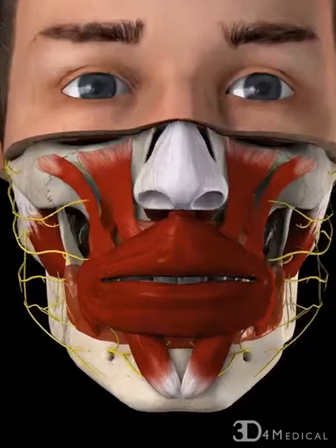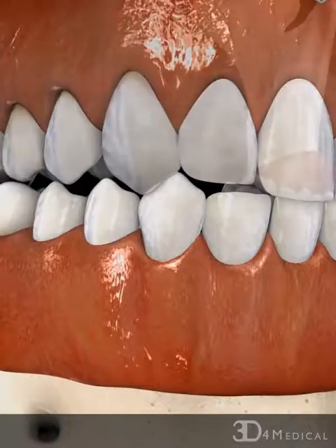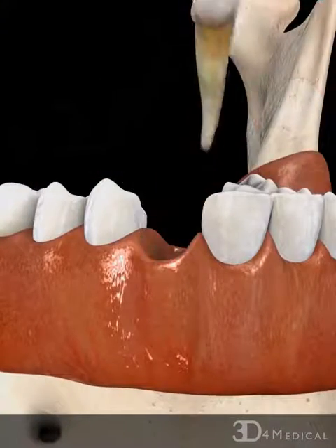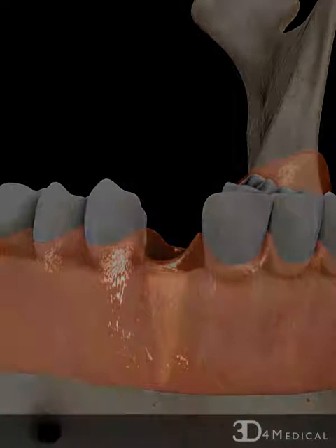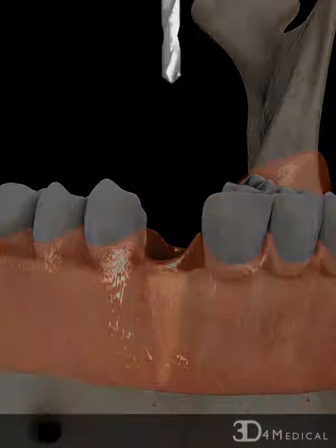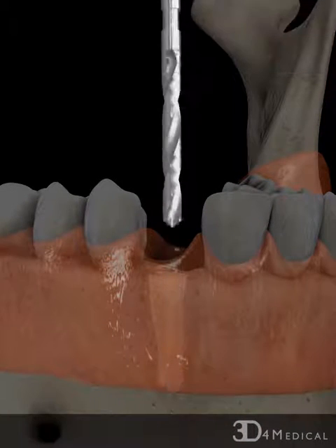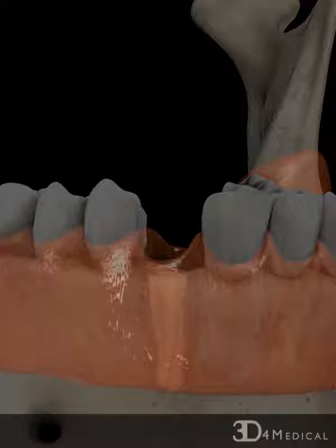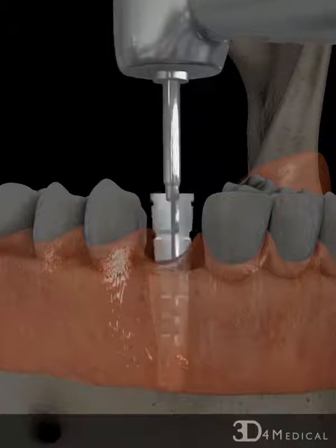The procedure begins with a surgical incision to expose the bone underneath the gum. The jawbone is then prepared for the implant using a number of drills to create a socket which is the correct size for the implant.